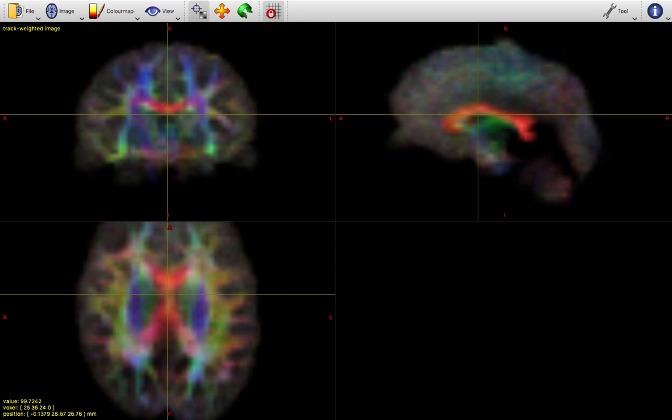Also on the same topic, have you read about multi-shell collection and why there is a connection to being able to calculate neurite density or even myelin density? I mean, they're all white matter. How can you use the multi-shell to estimate those little axons or protrusions? I'm just dipping my toe into the ocean as far as multi-shell is concerned. I haven't analyzed any multi-shell, so I can't speak too much to that, and I haven't read too much about that particular issue either.